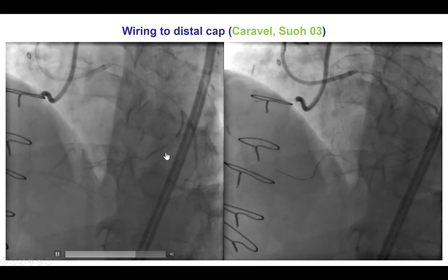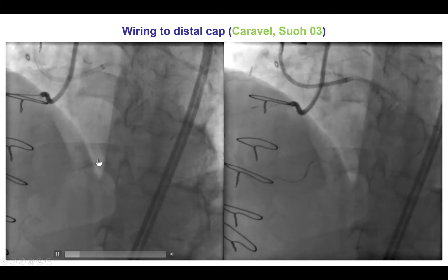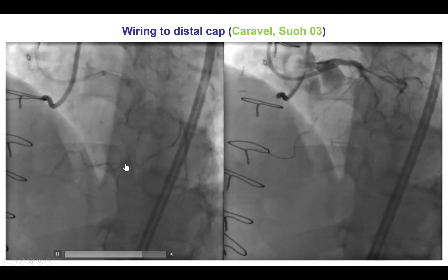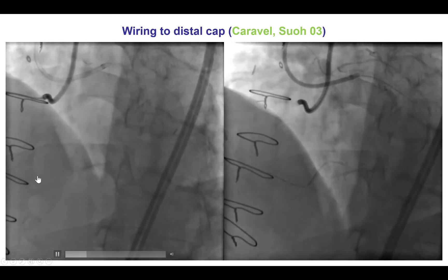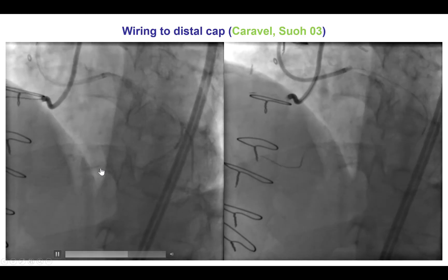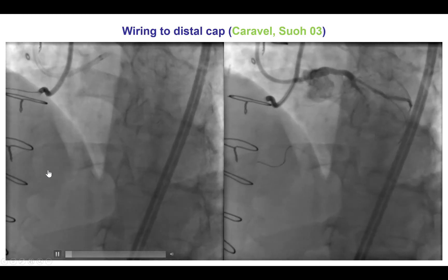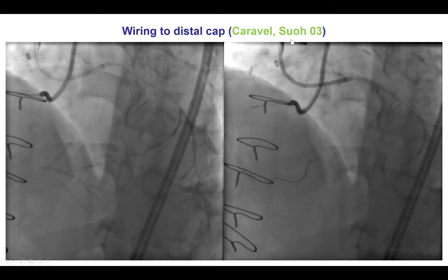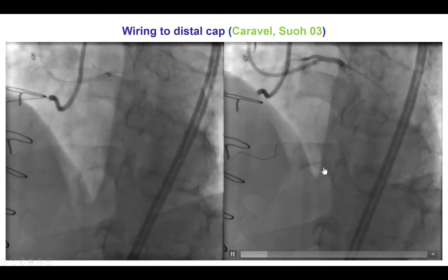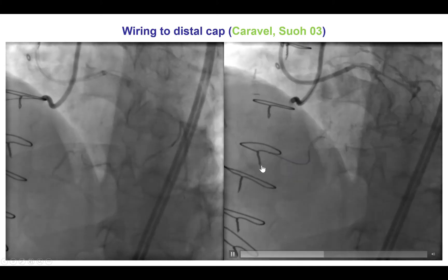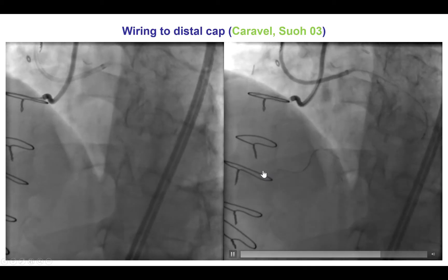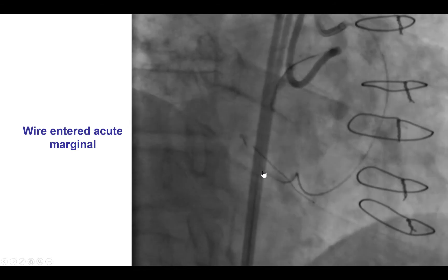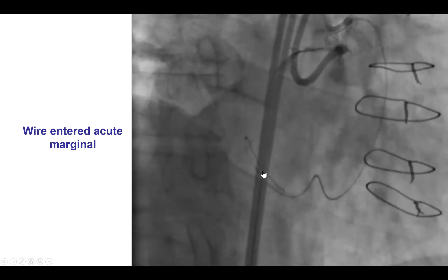We were then able to visualize the presence of a fairly good-size collateral. It did have some tortuosity but appeared to connect nicely with the right posterior lateral branch. We used the Caravel microcatheter and Suoh 03 guidewire and were able to successfully advance the guidewire all the way into the distal target vessel and into an acute marginal branch at the distal cap.